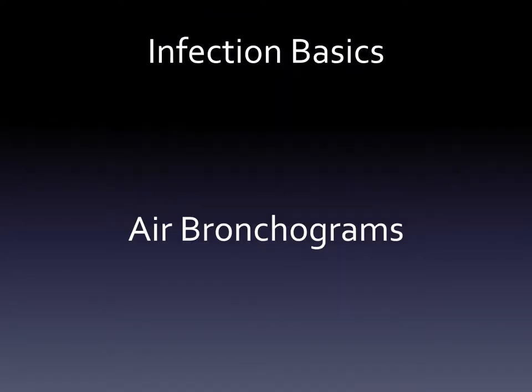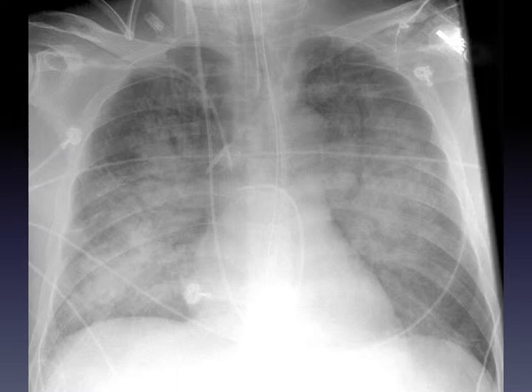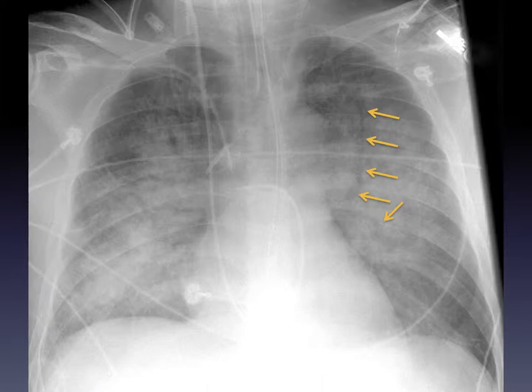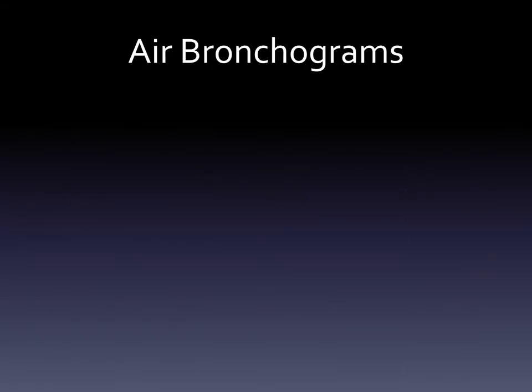The other topic I wanted to mention before we talk about different types of infections is the concept of air bronchograms. Here's a very sick patient — there's lots of material filling the lungs, so the lungs are very white. Because there's so much opacity, we can actually make out a tubular, darker structure going up towards the patient's head. Here I'll highlight it with some extra arrows — you can see this tubular, low-density structure going up, and in fact we can see some other tubular structures elsewhere. These are the air bronchograms.